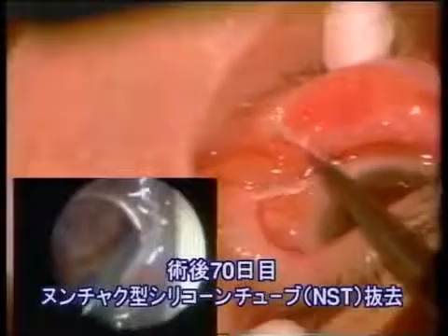Rhinostomy is created in the membranous nasal lacrimal duct, which runs on the temporal wall of the inferior nasal meatus, using a semiconductor laser.